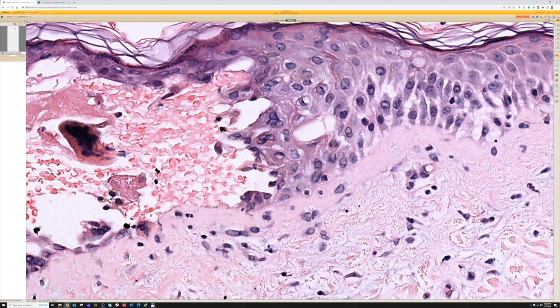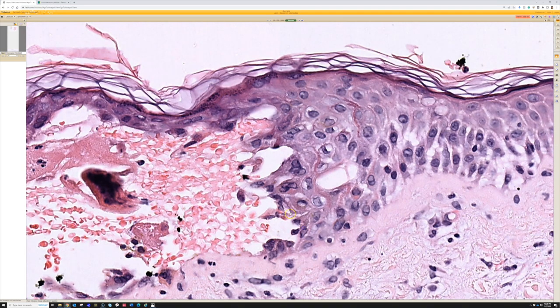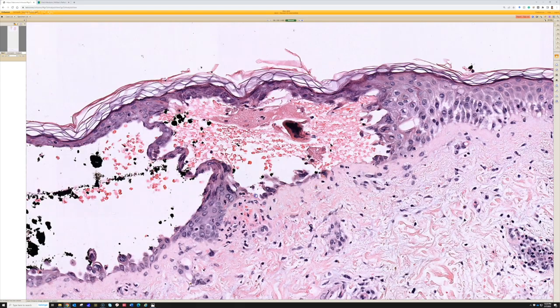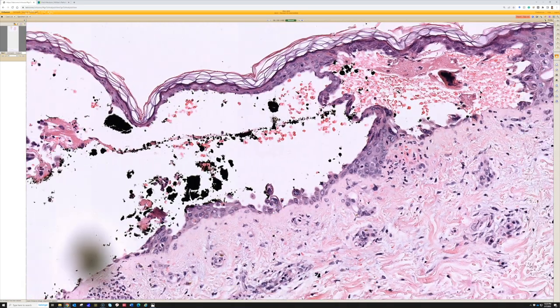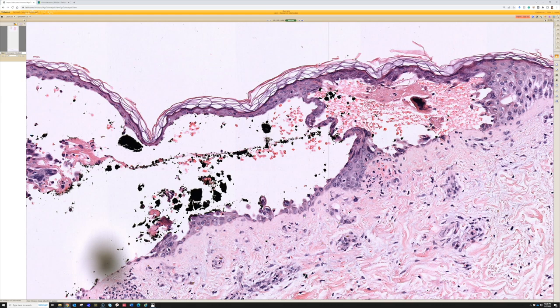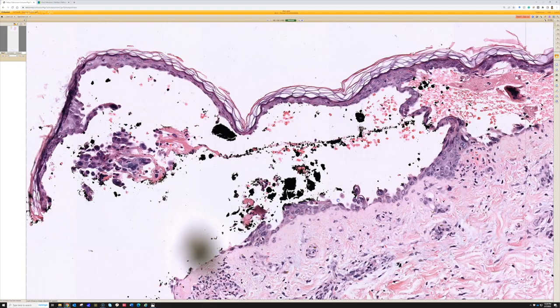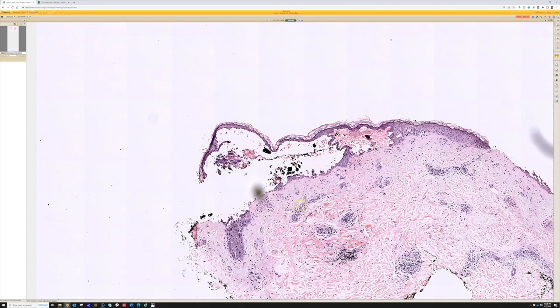I will often do immunostains for HSV 1 and 2 versus VZV because I have them readily available. My treating dermatologist colleagues usually like to know which one it is, as it does change the medication regimen. Otherwise, I just call it herpetic dermatitis and add a comment that I can do the stains to sort out HSV versus VZV if clinically indicated upon request. So this is herpes.